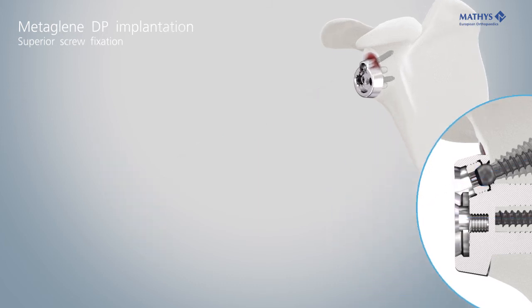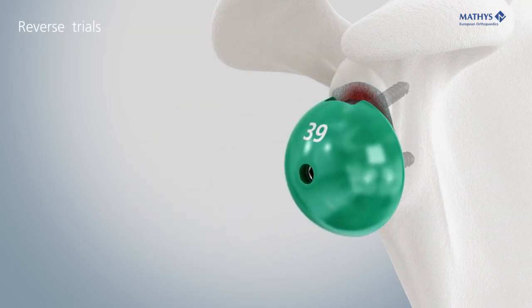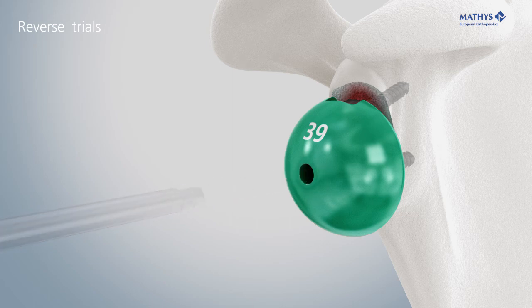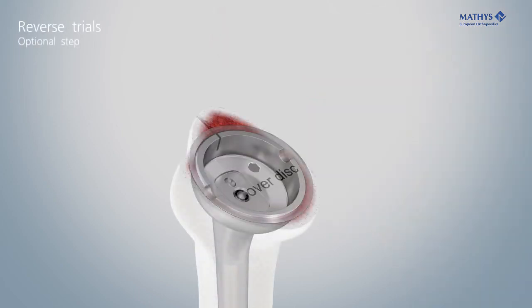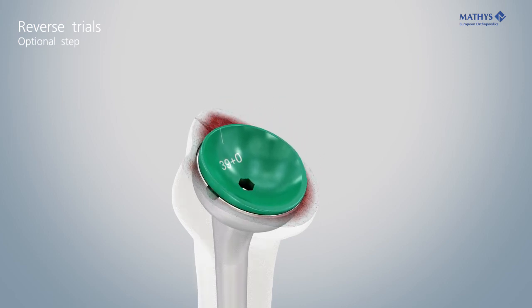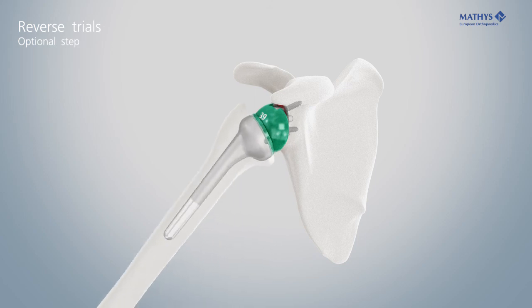The trial glenosphere can be mounted and secured for a trial reduction. Insert the trial inlay. Perform the reduction and verify the function.